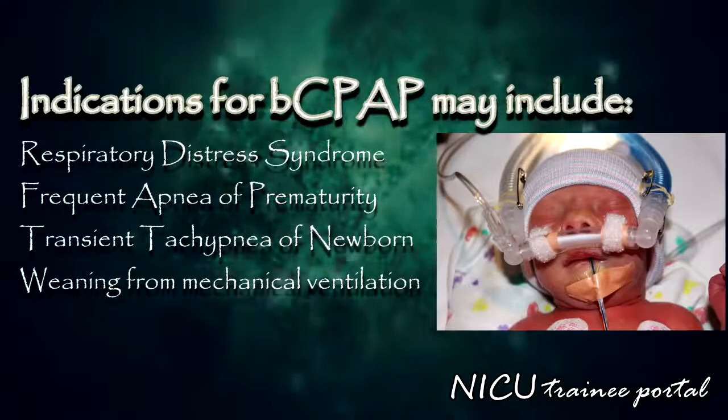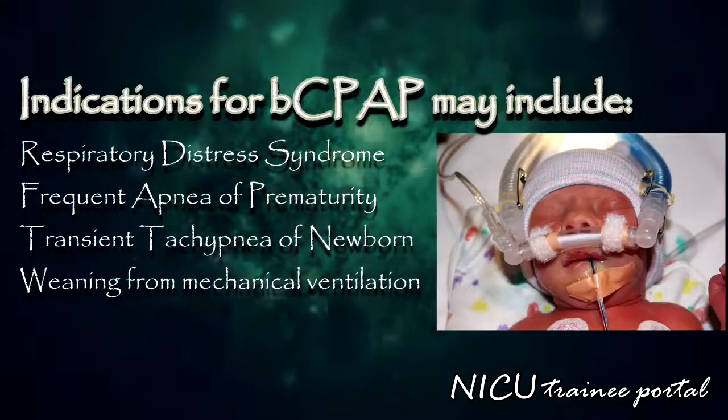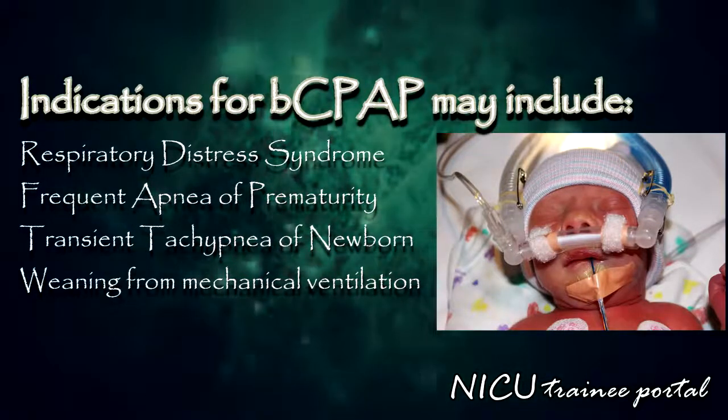Indications for bubble CPAP may include preterm infants with respiratory distress syndrome or those who have frequent apnea and bradycardia of prematurity, transient tachypnea of the newborn, and infants who have weaned off mechanical ventilation.